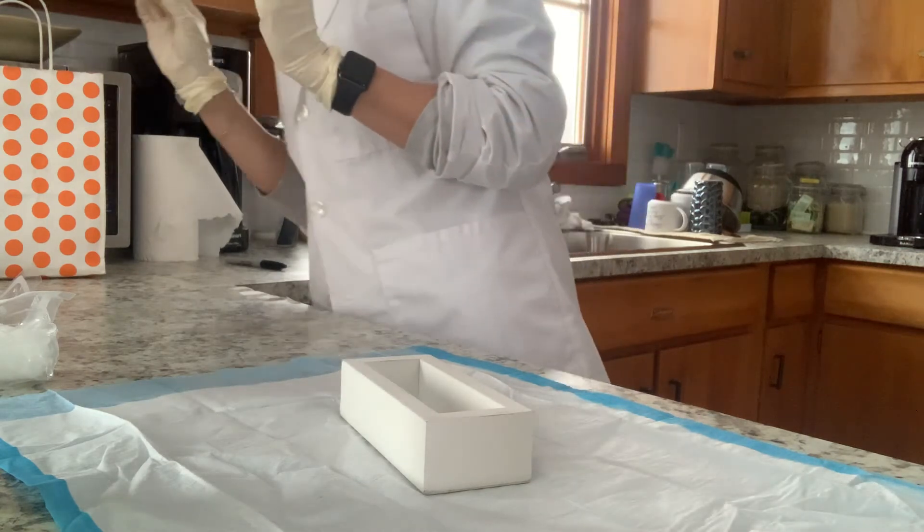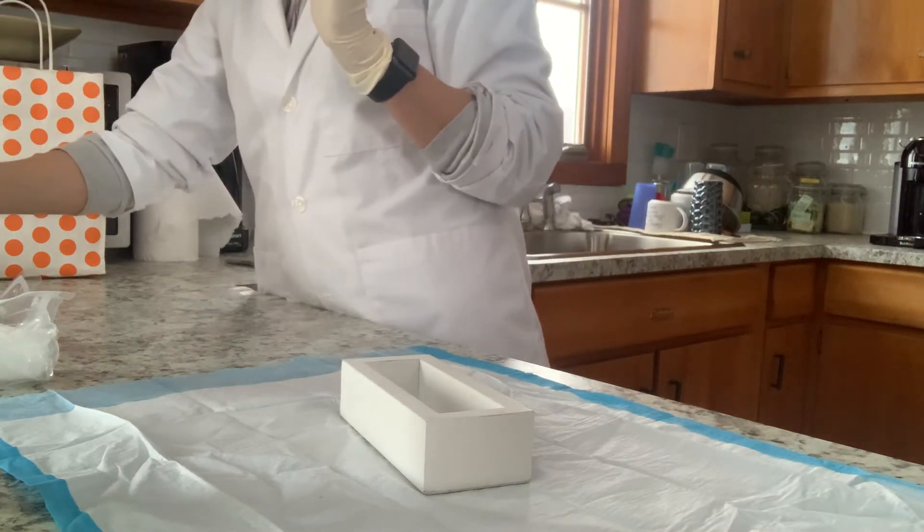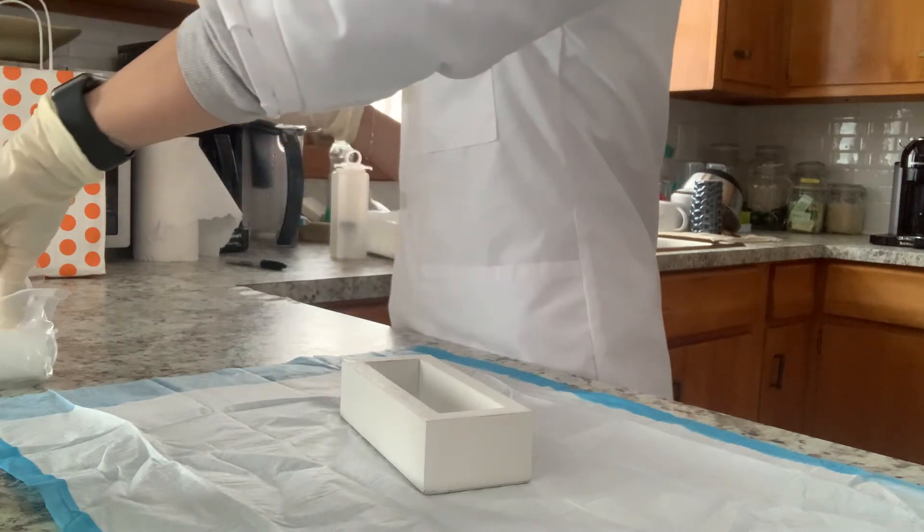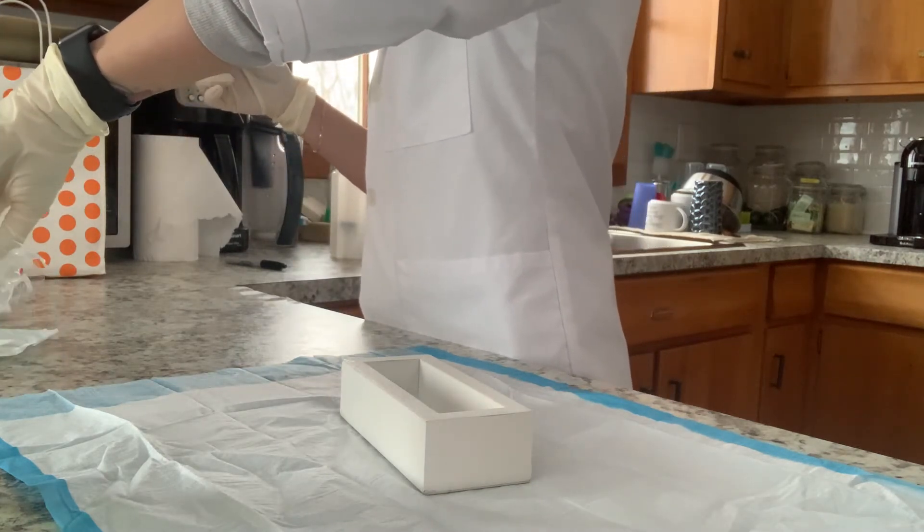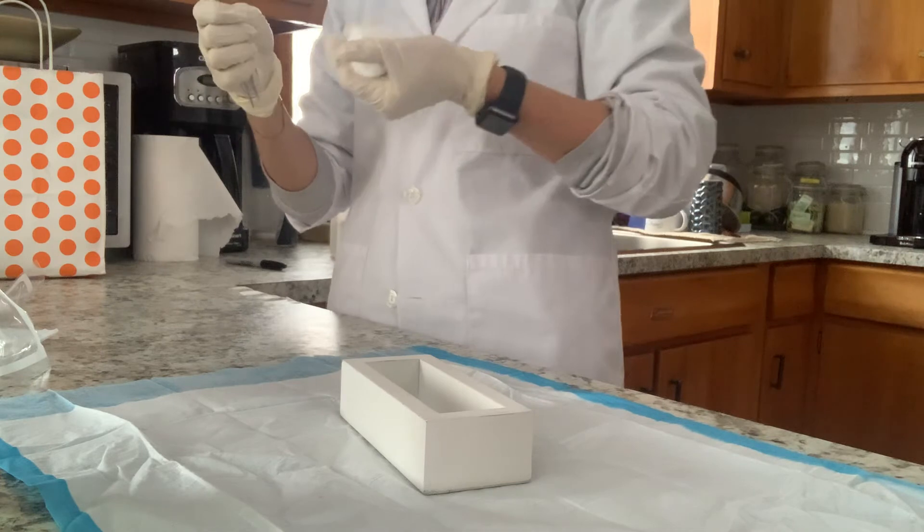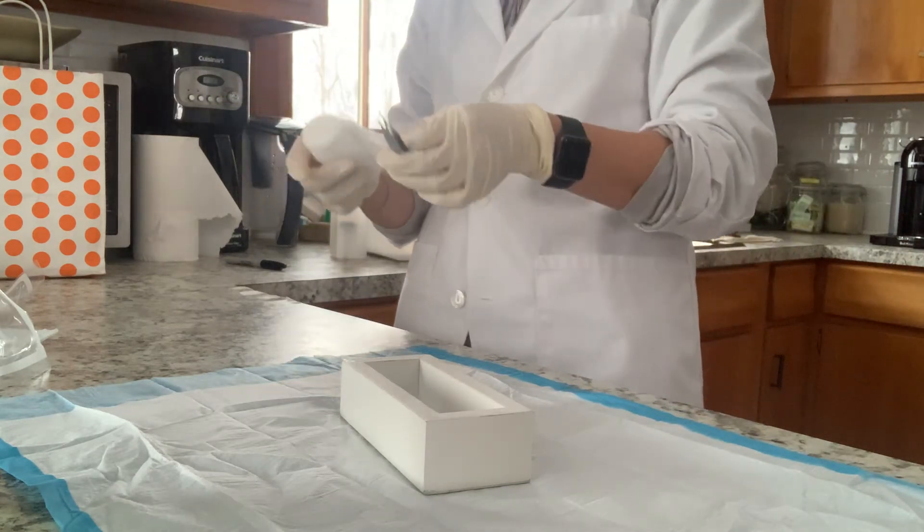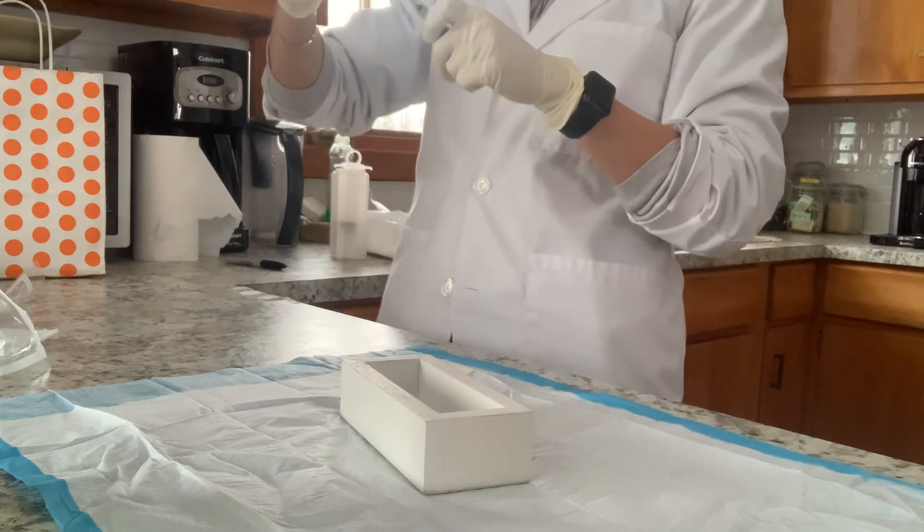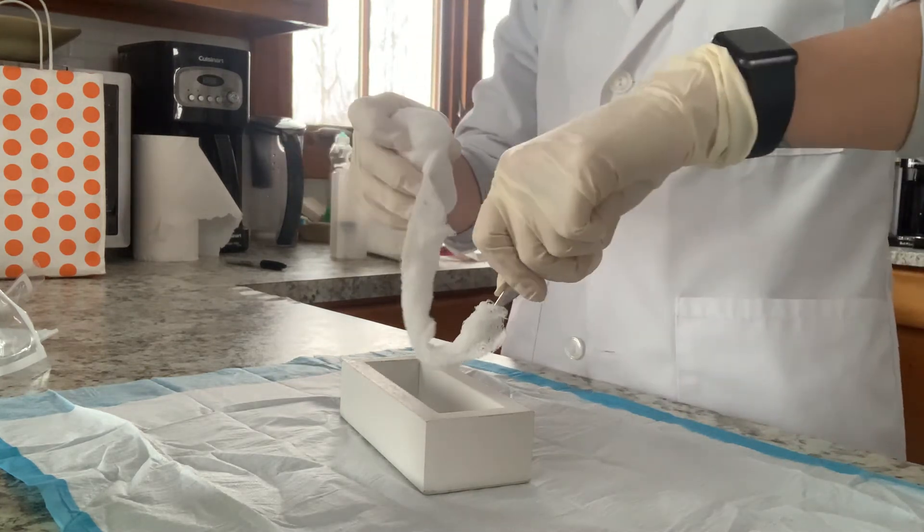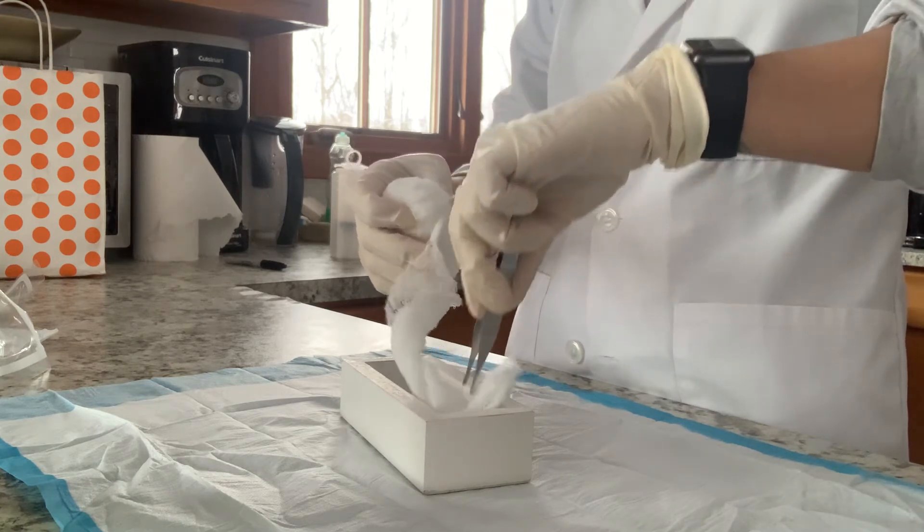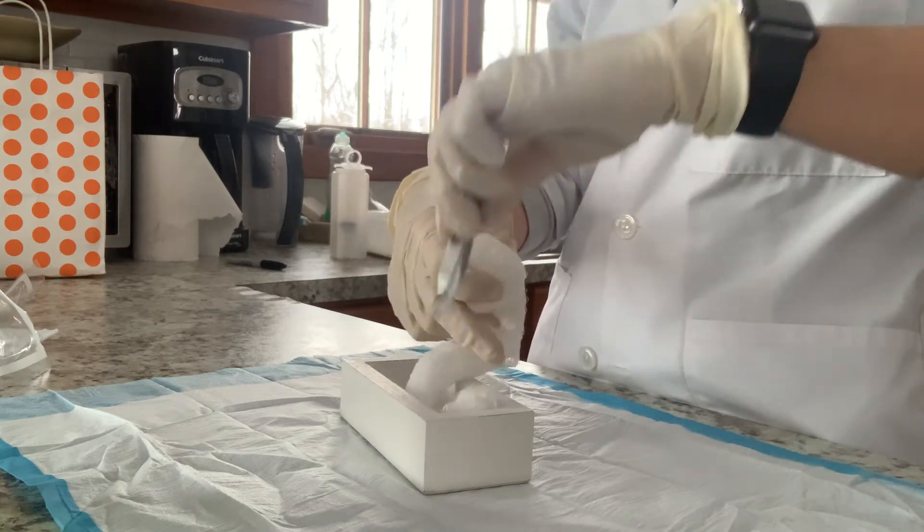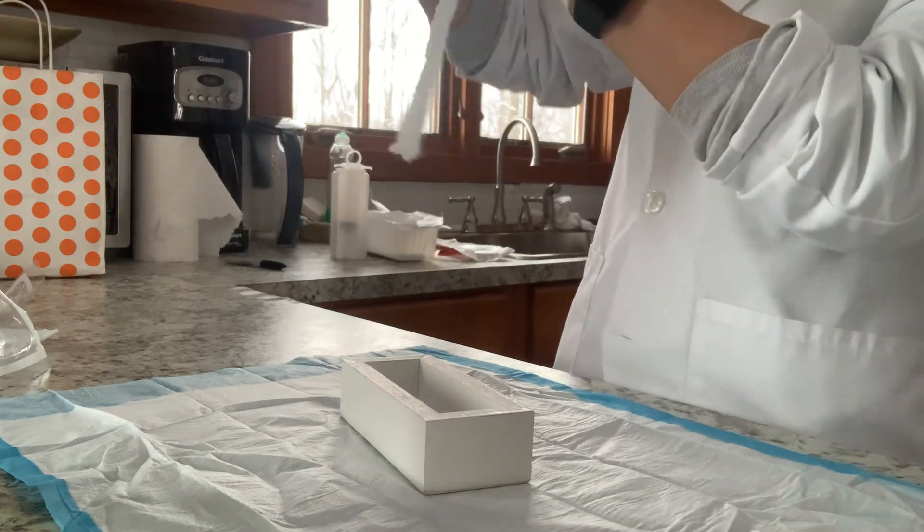So what I'm going to do first is grab my tweezers out of my suture kit and I am going to take my gauze and I am going to wring it out. Some people wring it out prior. I was taught to wring it out now. So what you would do is you would take the end of your gauze. I apologize for my son crying. If you can hear that, you're going to twist it and you are going to gently pack the wound. You don't want it packed too tightly. You also don't want it packed too loosely. So of course it's stuck to my tweezers. So we would start over again with this part.